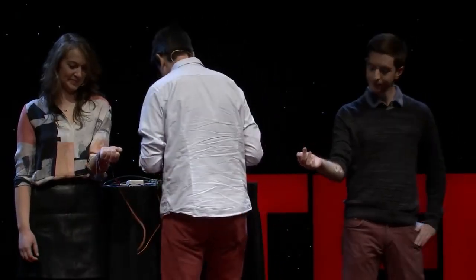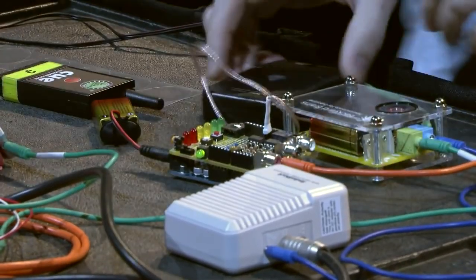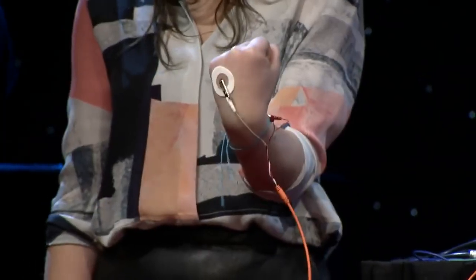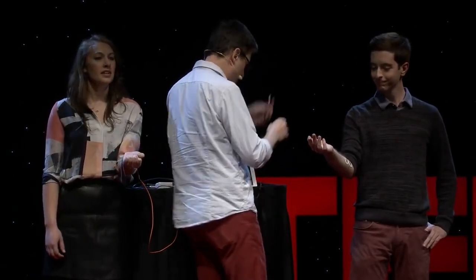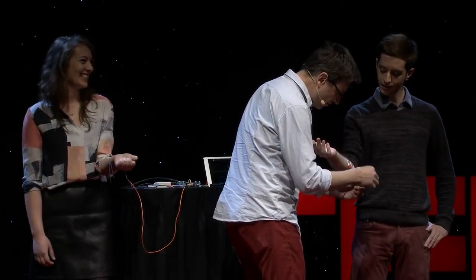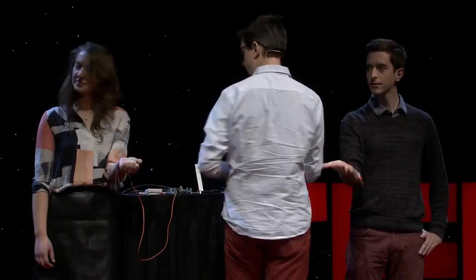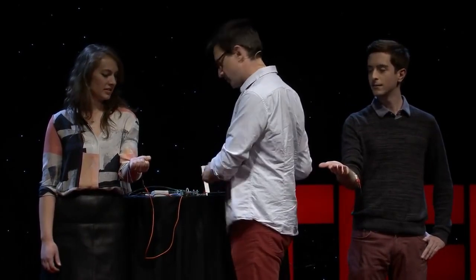So now I'm going to move away and plug it into our human-to-human interface over here. Sam wants you to squeeze your hand again. Do it again. So now I'm going to hook you up over here so that you get the stimulus. It's going to feel a little bit weird at first — you know, when you lose your free will and someone else becomes your agent, it does feel a bit strange. I want you to relax your hand. And Sam, are you with me? You're going to squeeze. I'm not going to turn it on yet, so go ahead and give it a squeeze.